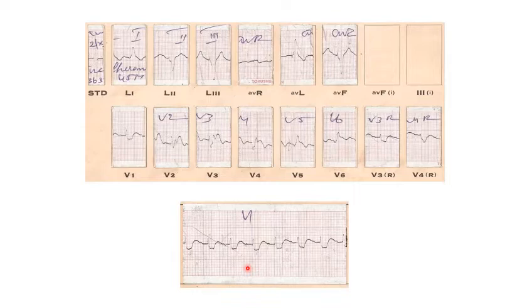Anything else? Sir, in leads 2 and 3, there is fragmentation in the beginning of the QRS complex. Yes, there is some fragmentation. More important than that, what is happening in leads V2 to V6? ST coving and T inversion, and also presence of a Q wave in LBBB.